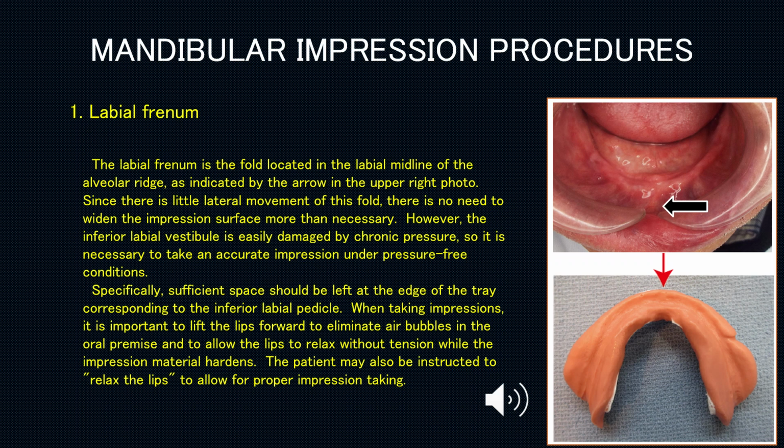One. Labial frenum. The labial frenum is the fold located in the labial midline of the alveolar ridge, as indicated by the arrow in the upper right photo. Since there is little lateral movement of this fold, there is no need to widen the impression surface more than necessary.